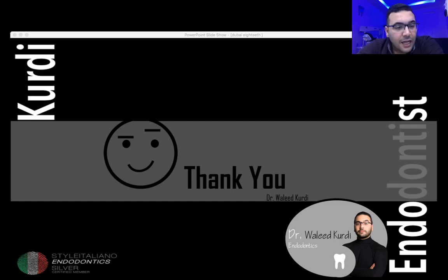Another question. Which movement can we use when we use BTR pen for retrieval? This is a good question. Dr. Amira Adil, great question. Once you engage the broken or the separated instrument, you can just make some buccal and lingual, mesial and distal movement just to move or to vibrate the file a little bit and then to pull the file.